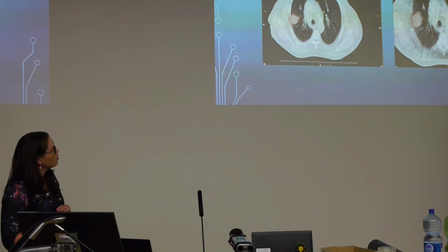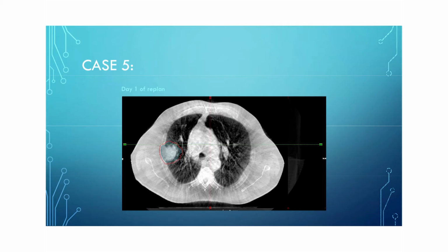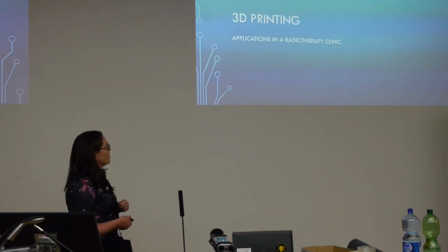Day 1 looks slightly bigger, and then we just replanned with that increased margin to make sure that we're going to cover what we see. So I'm going to talk a little bit now about, as I mentioned earlier, the surface contour and how we adapt to that. And this is not my work.